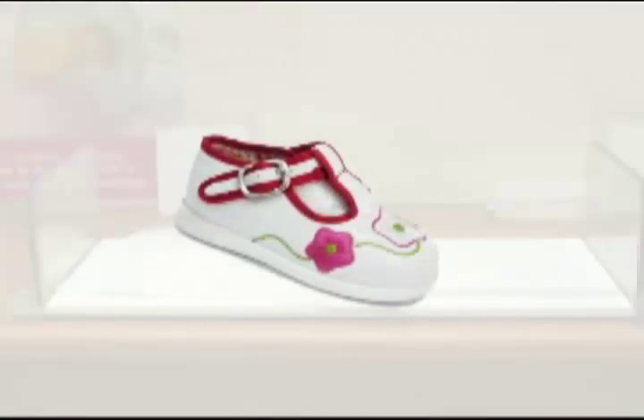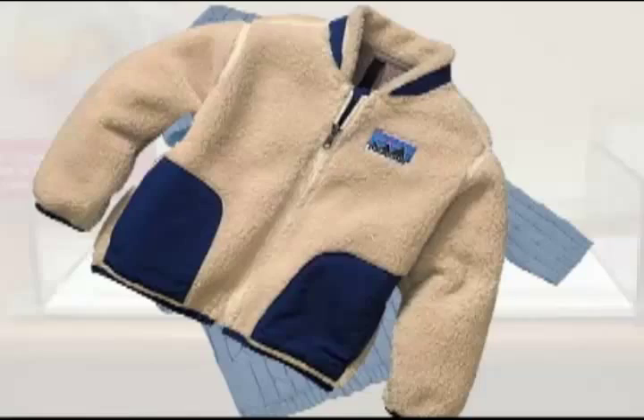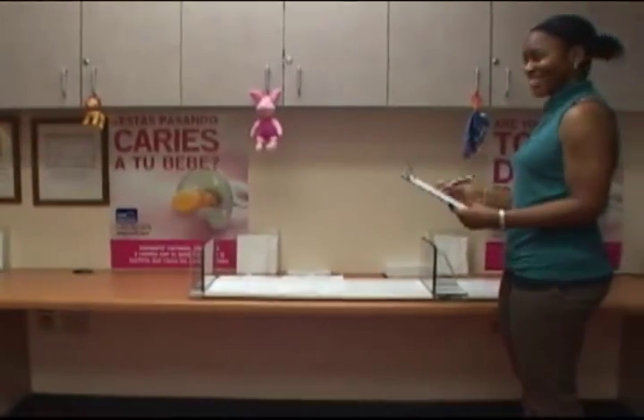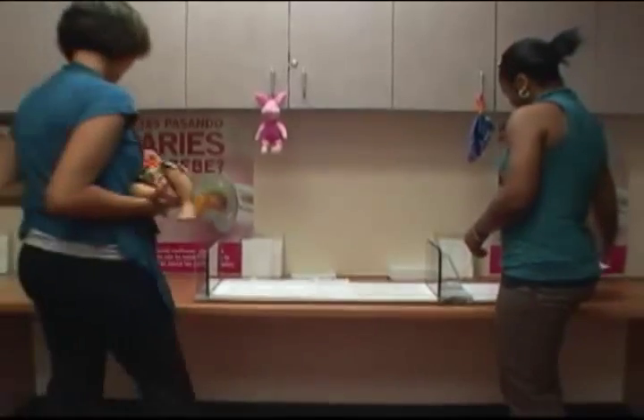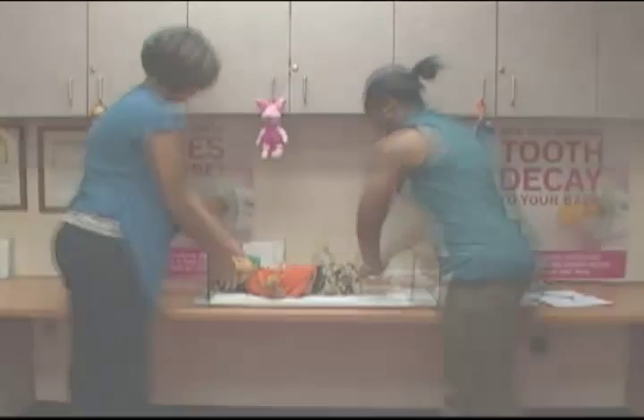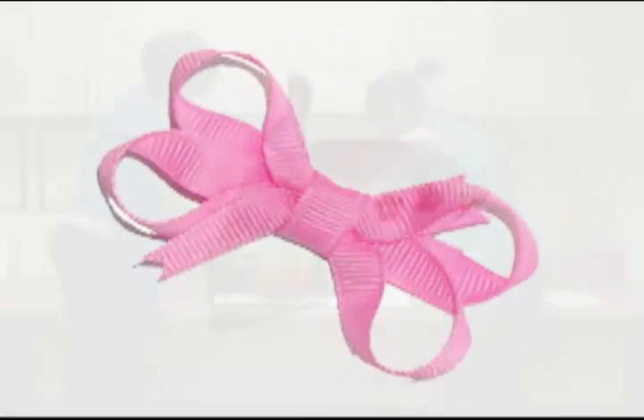Now, we'll be measuring the length of a two-month-old infant using a recumbent length board. Before measuring, have the caregiver remove shoes and any heavy clothing the child might be wearing. Make sure a paper liner is placed onto the board and the child's diaper is dry — have the caregiver change it if necessary. Since the headboard needs to rest flat against the child's head, make sure anything like hair clips or hats are removed.